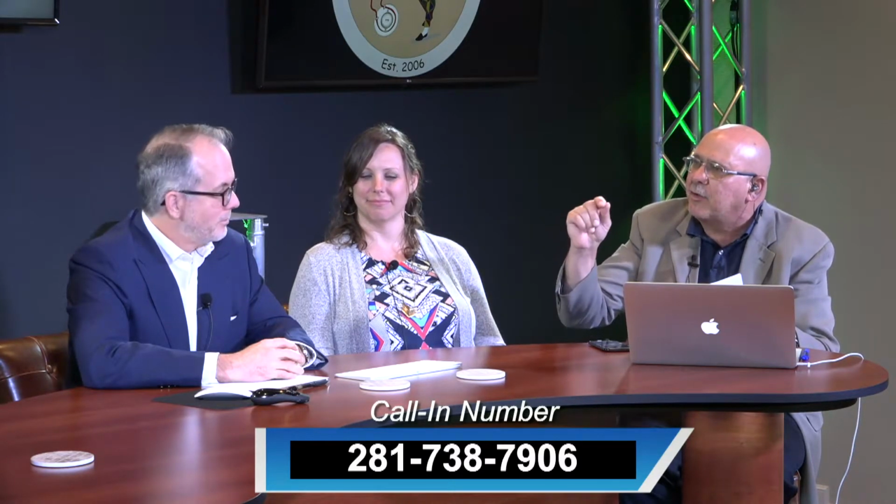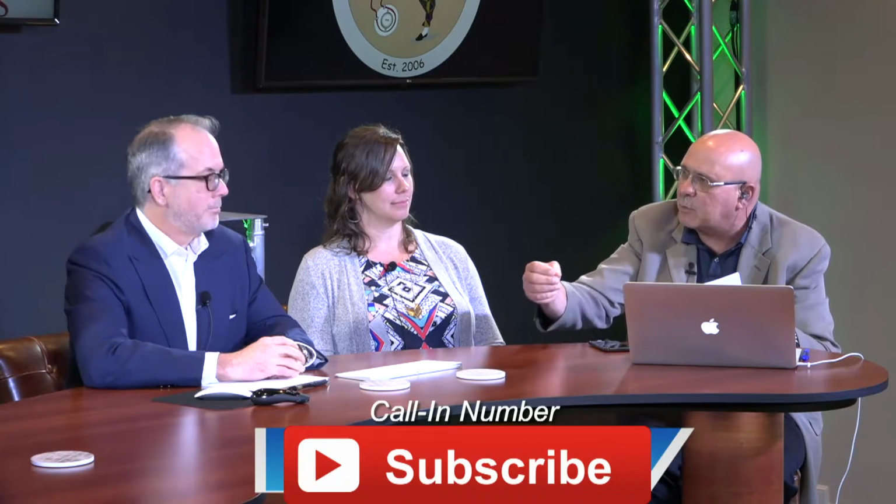But I want you to highlight that one point that you made earlier as well. The point about ECMO is that it's there to buy you time. It's a support tool, but you have to fix whatever the underlying problem is. I think that's going to be my takeaway message for this evening.